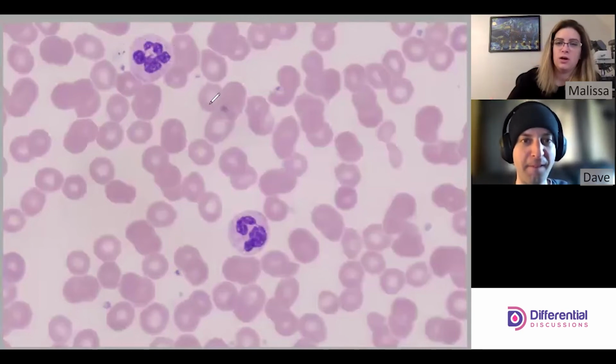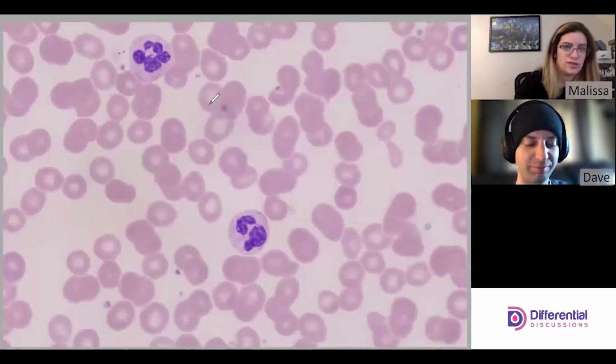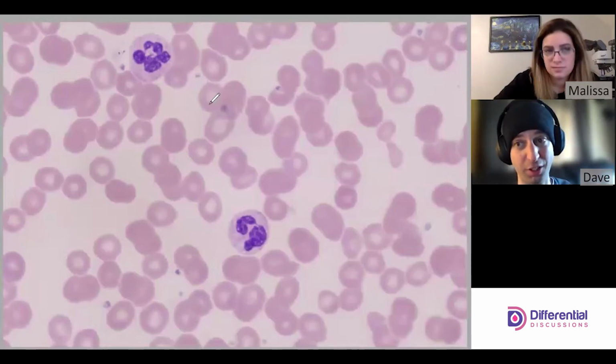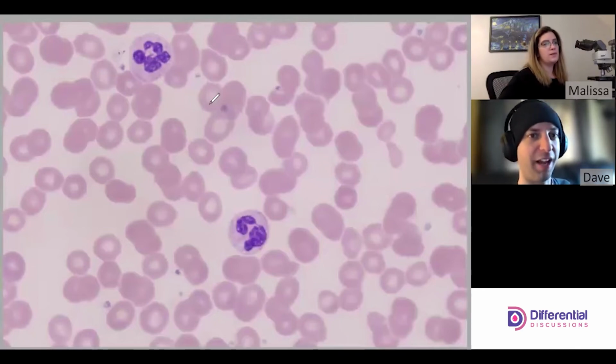But you can see that more of the neutrophils tend to have 4 or 5 lobes than the 3-ish kind of lobe, which is more traditional for our neutrophils. So even though they're not hypersegmented, the neutrophils still have a lot of segments. There's definitely a quantitative process, counting lobes, but there's a qualitative bit to this too that's harder, that comes with more experience. But I agree with you 100% that one on top, even though it's in range, it's starting to show.